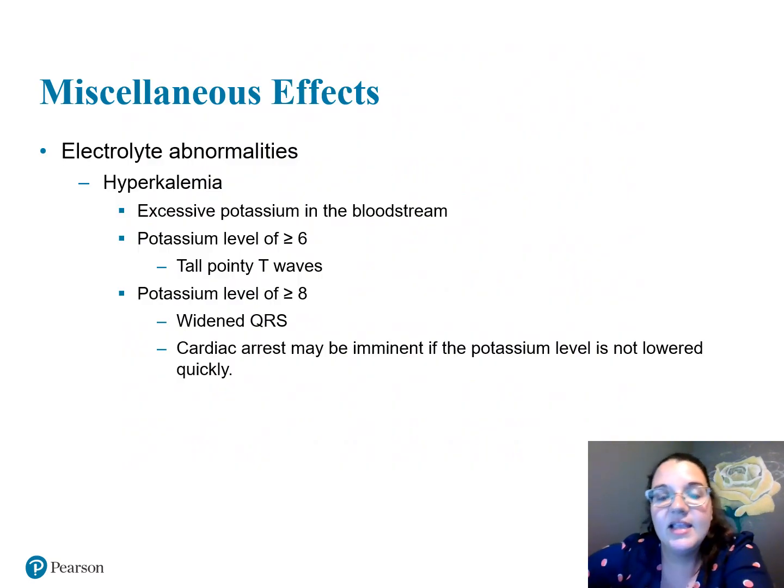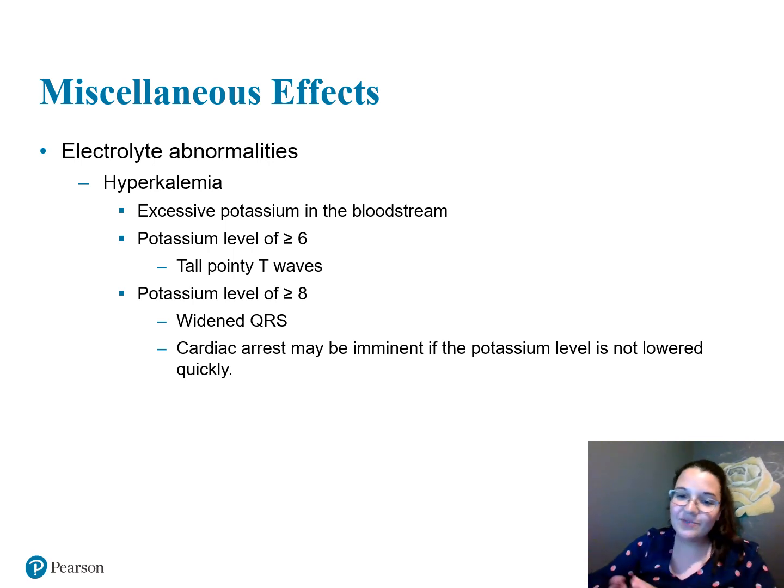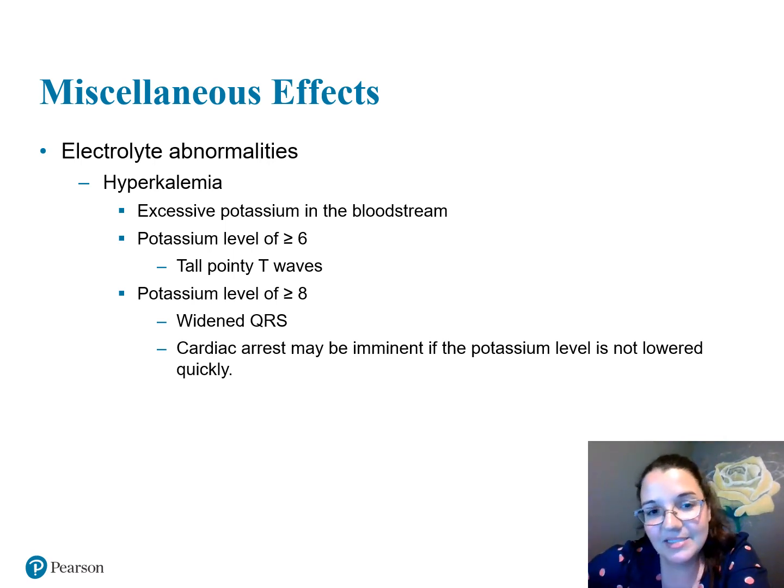All right. Another effect is called your electrolyte abnormalities. Okay, phlebotomy students, we talked about this. This is where another part where EKG kind of comes together with phlebotomy. We have your hypers and your hypos.